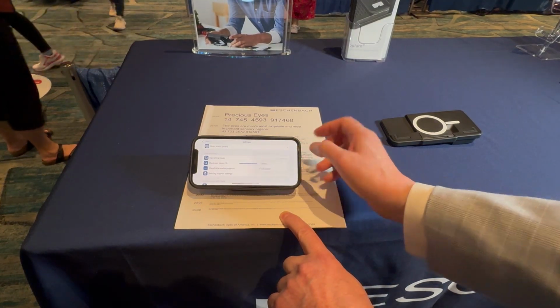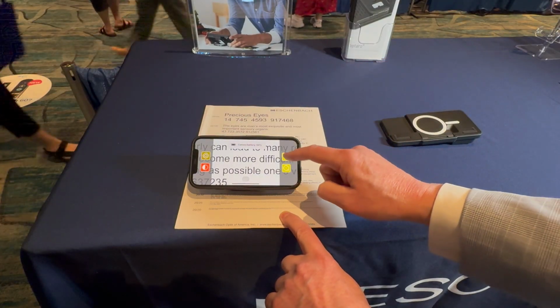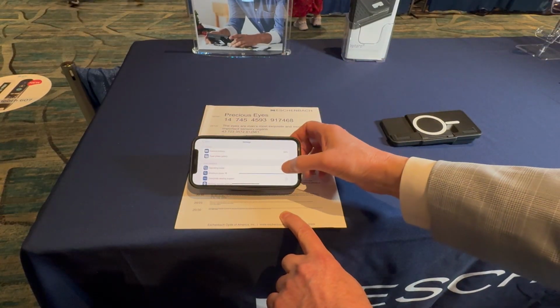So you can hit advanced and click the simple option, and then when I go back, now it just has 2 buttons on each side. Make it bigger, make it smaller, change the color, and then go back to the settings. So you can actually customize this based on the needs of the user.